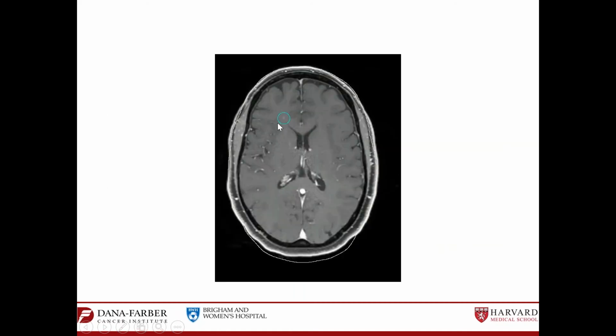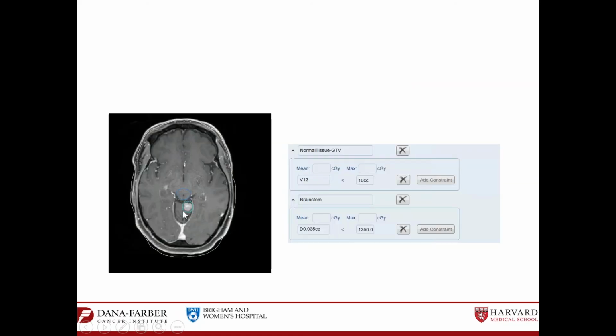And second, because the right frontal lesion was very tiny, so we could not have the alignment with one isocenter shared with the other lesion. The best result was to have one isocenter in this lesion separated from that lesion. So that was treated as 2 different plans, 2 different isocenters, the same day.